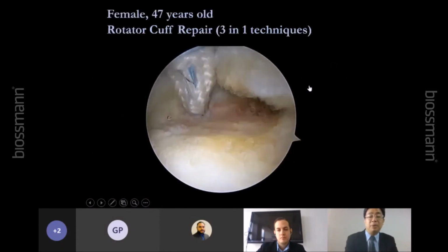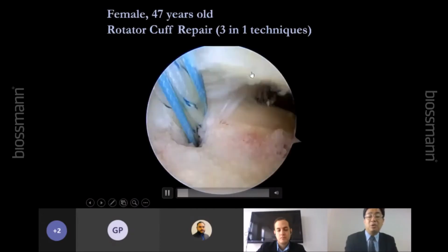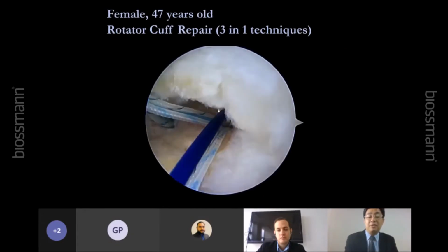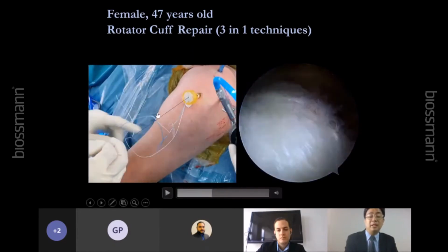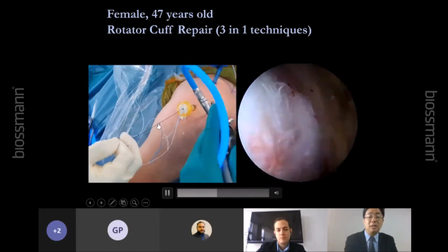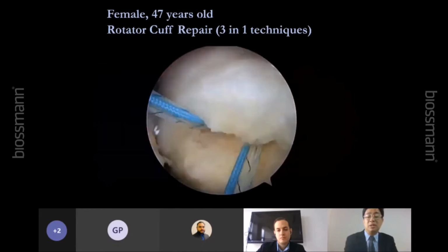So another example, this is a 47-year-old. She has a medium-sized cuff tear. So this is another 3-in-1. Okay. So the trick is when you do 3-in-1, you cannot pass 3 sutures in one shuttle because 3 is too big. So the trick is you put 2, right? You put 2 in one knot, another one, okay, in another knot. So you can make it pass 2 times, right? So like this, okay.